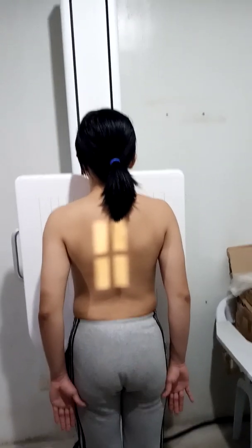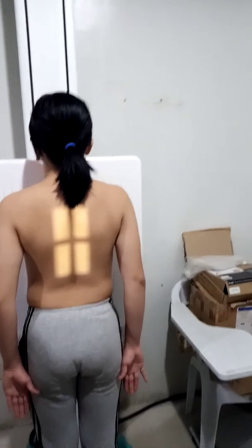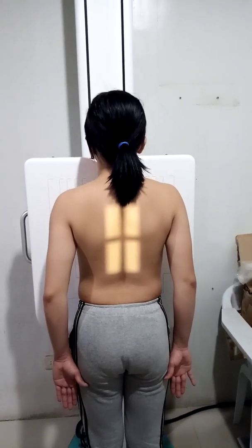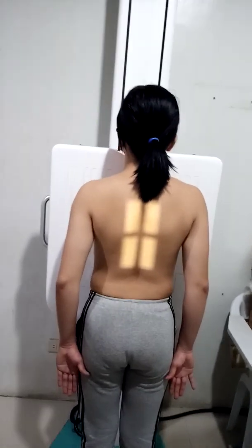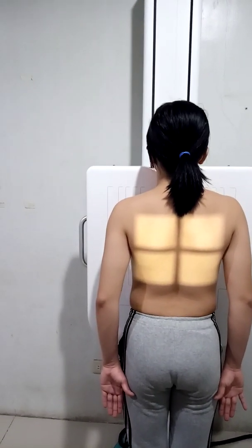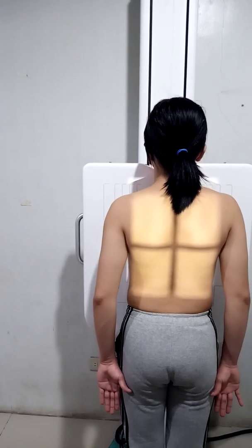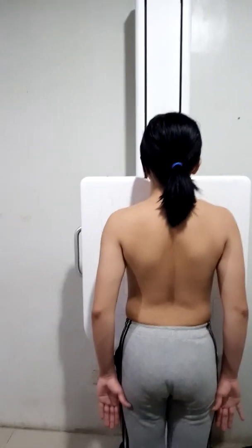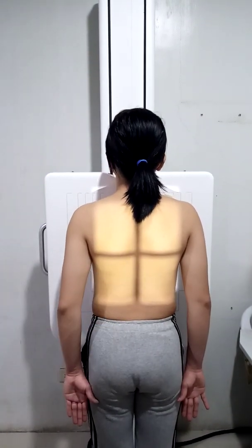The next one is the collimation. So first, the cassette that we're going to use is 35 by 43 centimeters, or 14 by 17 inches. Then in collimation, adjust the collimation to 14 by 17 inches. And the kVp that we'll use is 80.